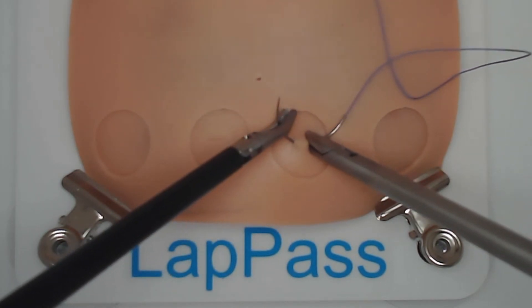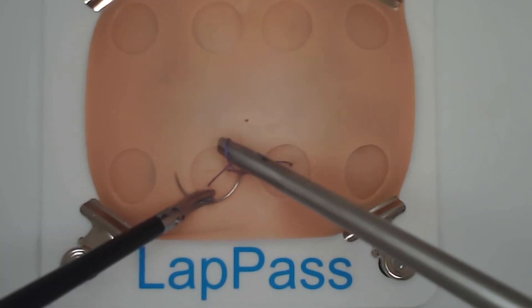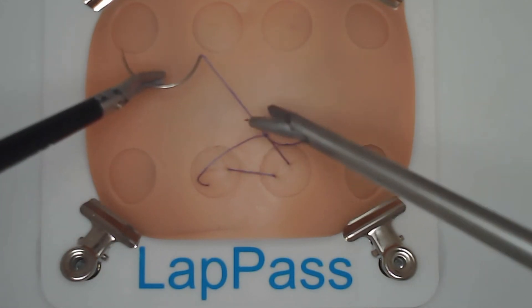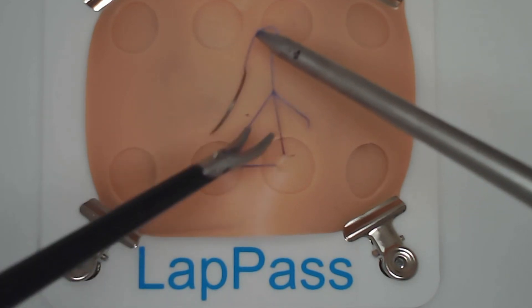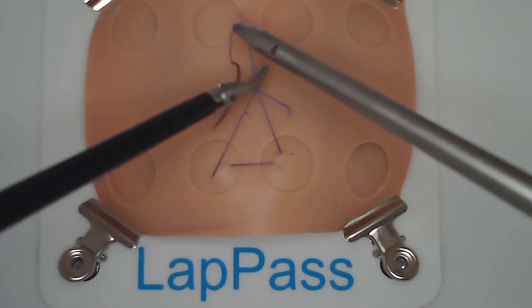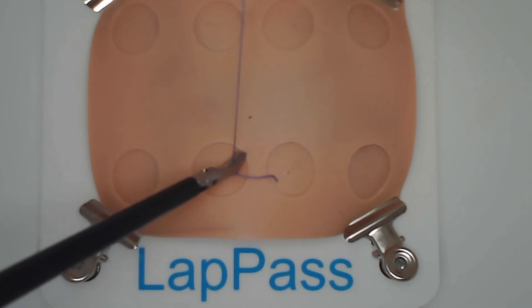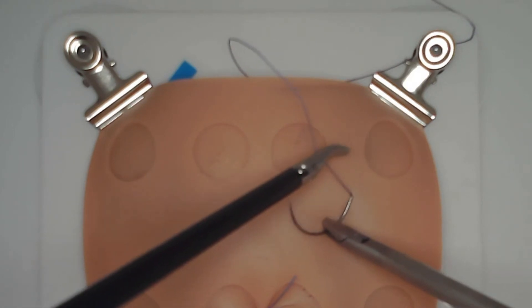Make sure you don't take too small a bite. If you take too small a bite of the tissues, when you come to pulling it under tension the suture pulls through. This wastes a lot of time and you may find you run out of the six minutes to complete the task.